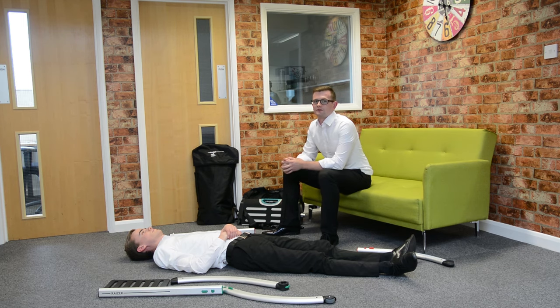The first thing to do is to make sure the person isn't injured. In this case there is no injury, so we'll proceed with the lift.